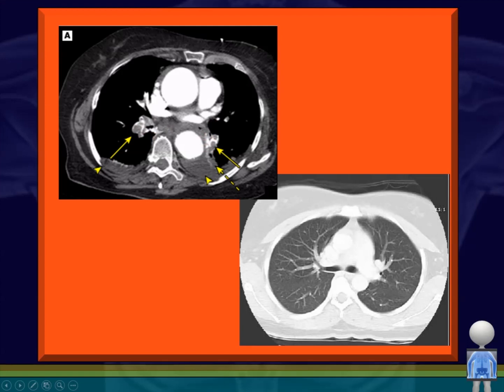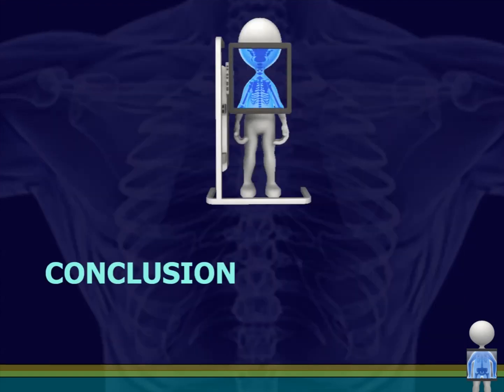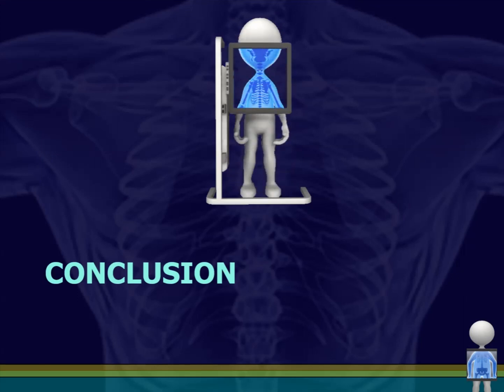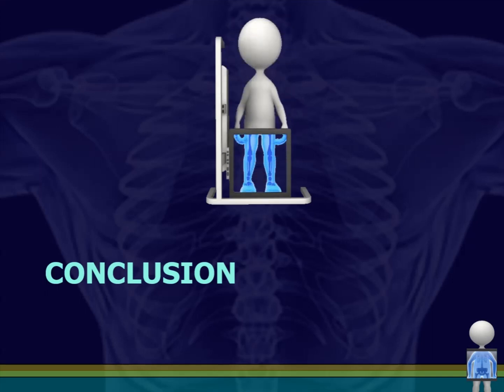So that's just a quick overview of CAT scan, but a little more in-depth view of X-ray. And what I need you to do in the most basic form, just to start looking at interpretation of X-ray. If you become an ER PA or an urgent care PA or a pulmonary PA, you're going to get much more advanced than what I've shown you today. But this is a good start. I hope you've all enjoyed it, and have a great day.